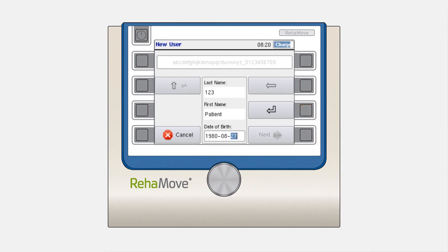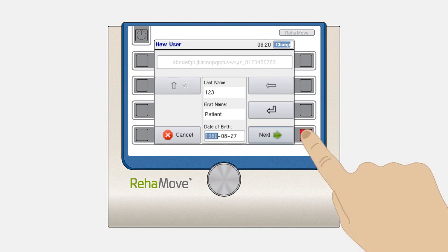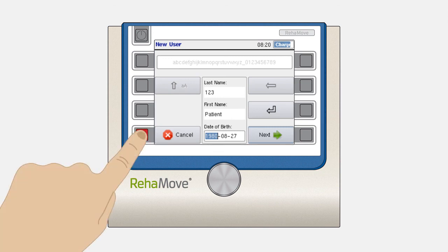When all the lines are filled in, the next button will become green and you can press this to continue. To cancel and go back to the main window, press the cancel button.